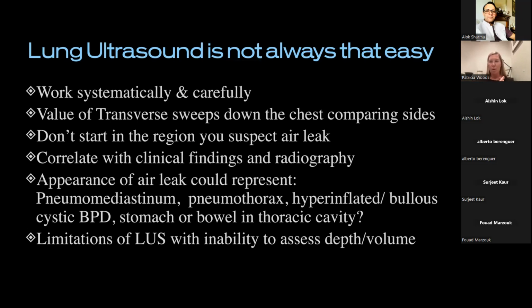And that will help you identify lung point. And then once you've done transverse, then please do longitudinal, two planes as you would normally with any sort of imaging. As I've said, try not to be tempted to start in the area you think is air leak. First up, do yourself a favor. What should it look like? Why am I staring at this point here for 45 minutes trying to find lung point? It might just be this baby's appearance.